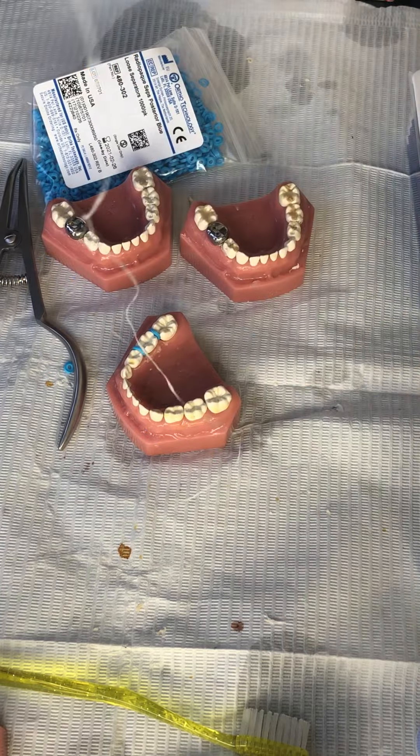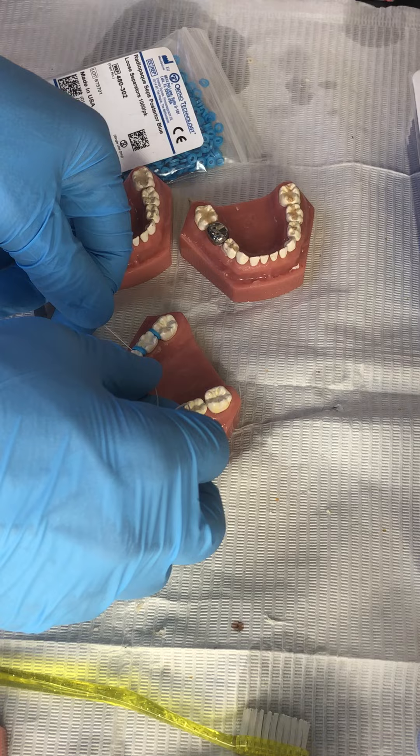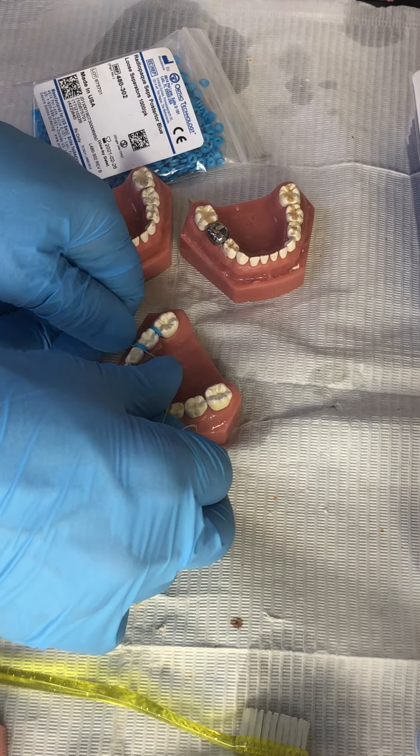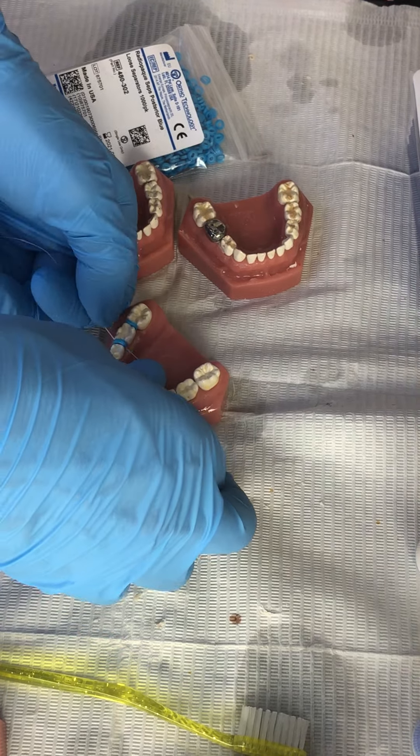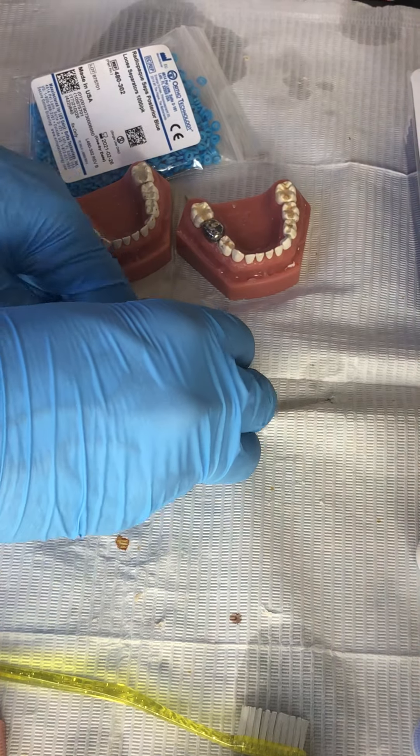The next day, kiddos, that region is still going to be a little bit sore and tender, so I don't like to put the Hall crown in the very next day. Three to seven days later, I like to just floss these guys out or take an explorer and remove them that way.